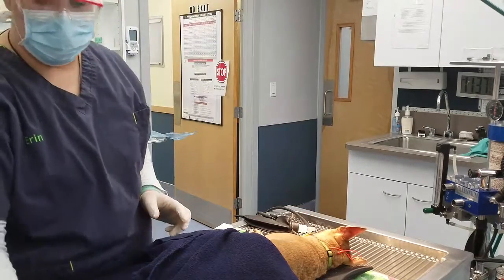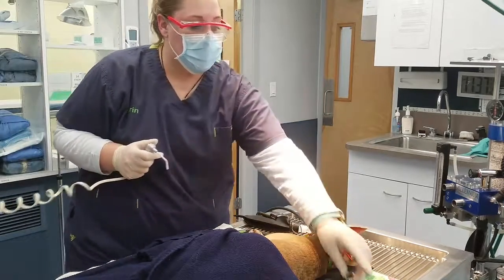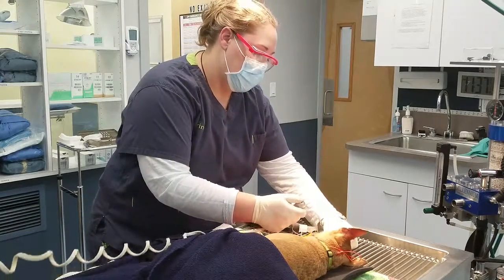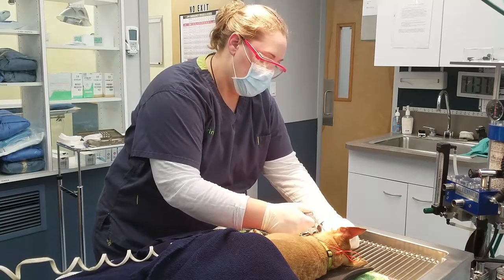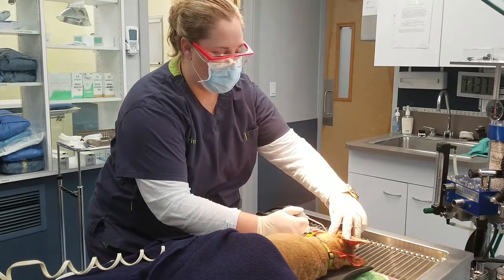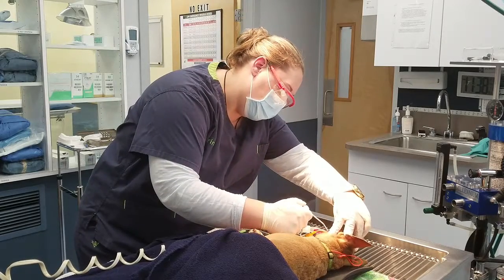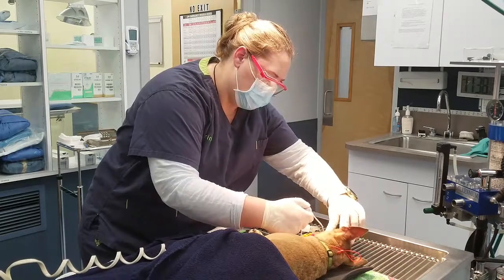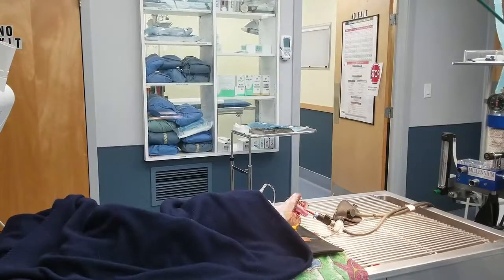So that's all the teeth the dog has left on the upper arcade on the left side. So now I'm going to go ahead and remove the excess polish with our air-water combination, okay? You don't want to leave any of the Prophy paste in the mouth or under the gums, because that can cause some abscessing and some discomfort for the dog, okay? Alright, so that side is done.